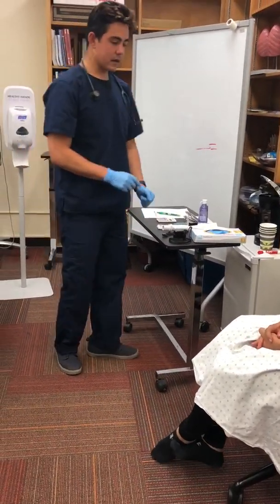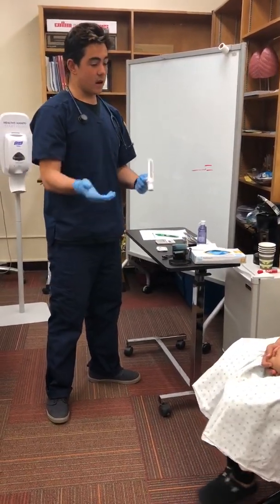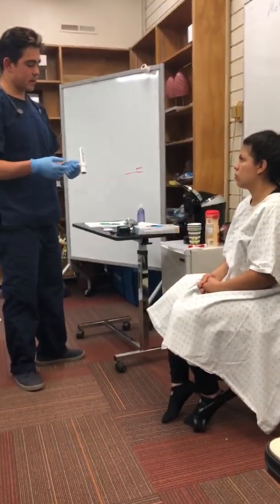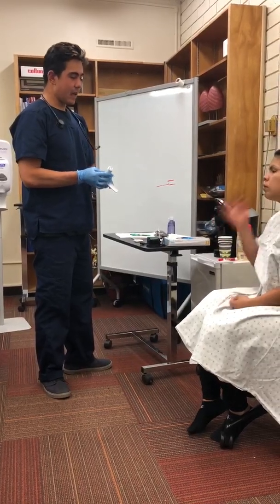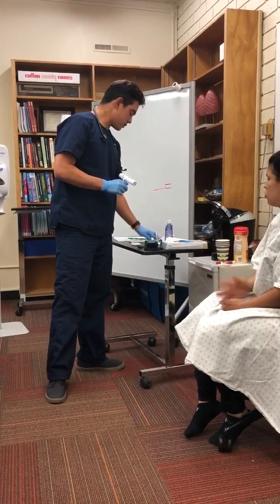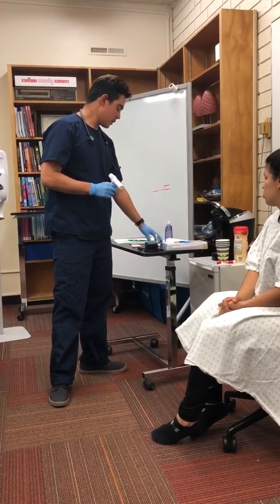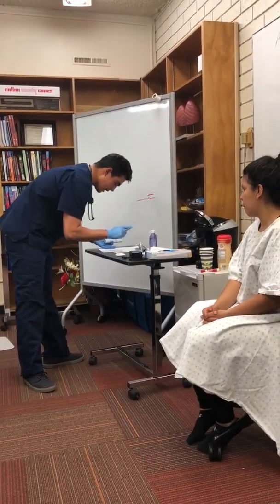Okay, so at this point we're going to test your ability to exhale air in a forced expiratory volume. It's going to be over a short period of time, okay? We're going to take 3 results, the best of 3, and compare that to your percent predicted. After reviewing your chart with your age and height, we're predicting that you're going to be blowing around 418, okay? So we're going to write down the predicted.